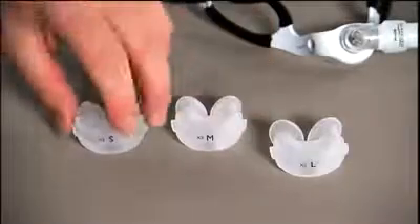To determine which size will be best for you, hold the pillow's cushions up to your nose. Select the one that fills your nostrils comfortably without any gaps between the pillow's cushion and the walls of your nostrils. The bottom rim of the pillow's cushion should not go into the nostril. This patient is a small.